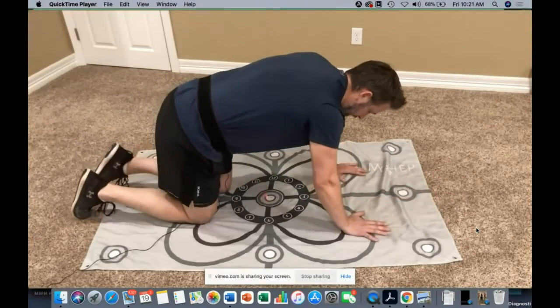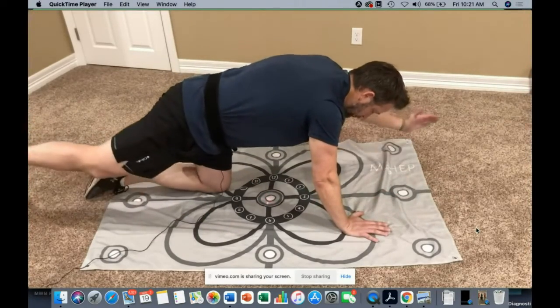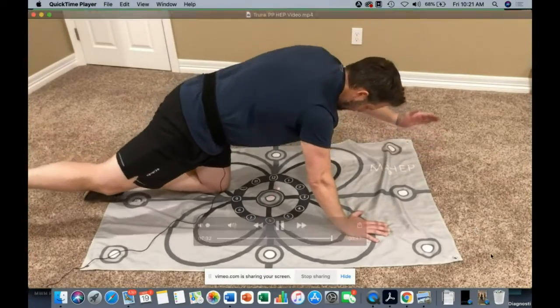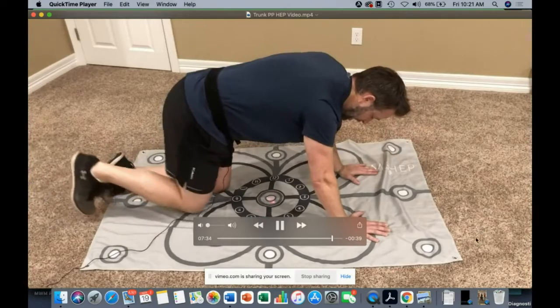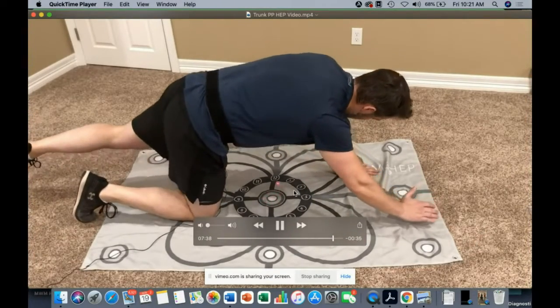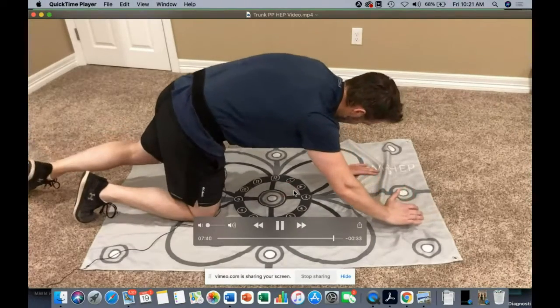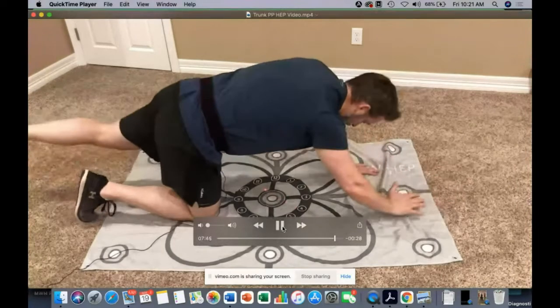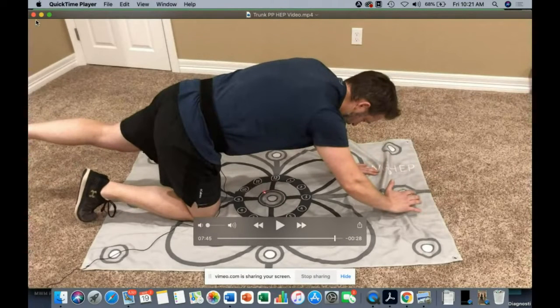You can implement this type of treatment and address that in a horizontal position rather than always just the vertical position. And of course, you can see me working on those number targets here, and the motivation of being able to move and call those out with different patterns. Okay, as an application there.